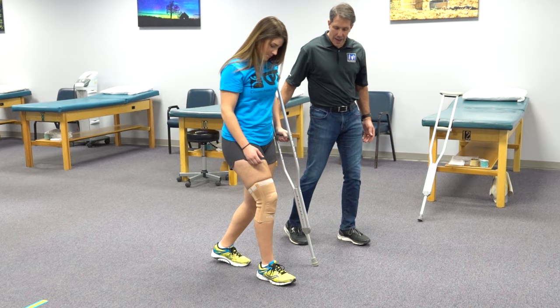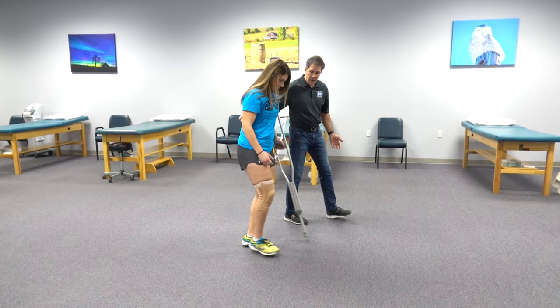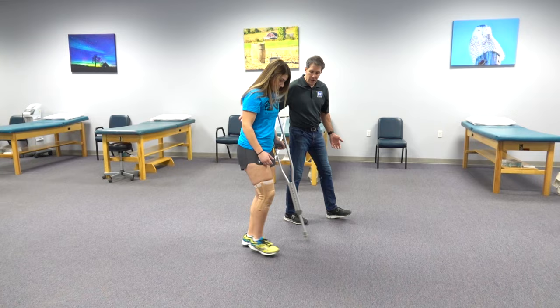As you become more comfortable with that and want to be a little more natural with your walk, you can swing through, you can step through — just like that. And that becomes much more natural while still taking weight off your leg and also using the crutch for balance.